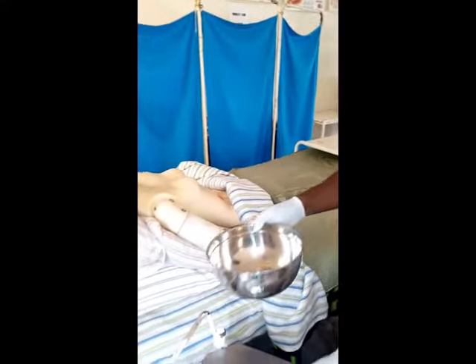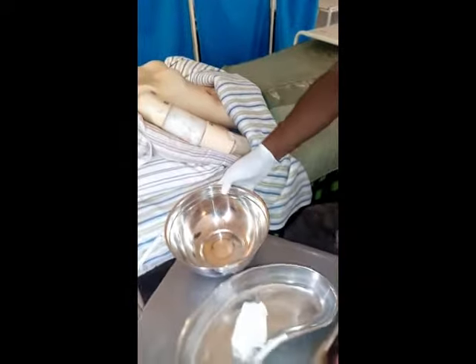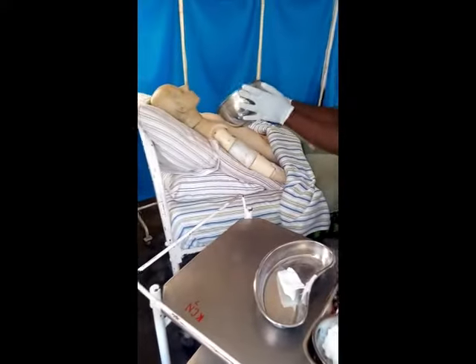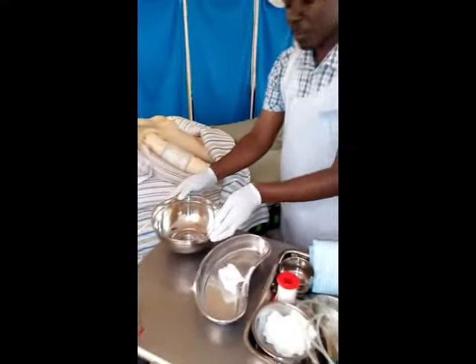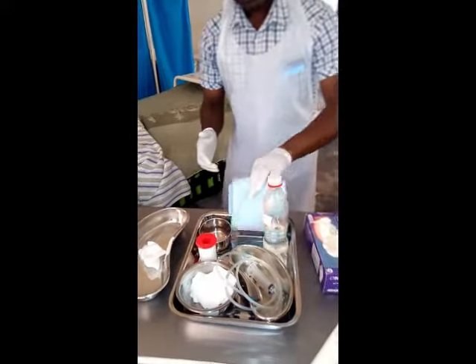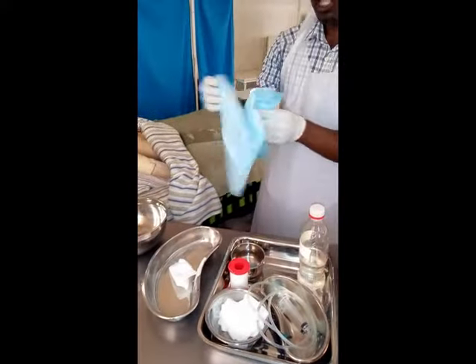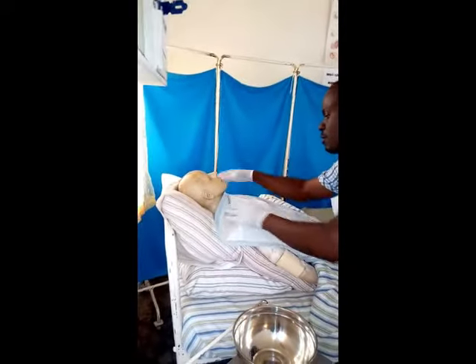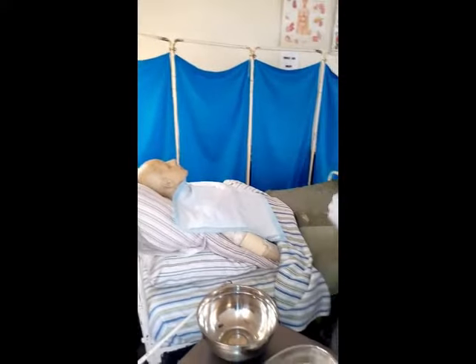I would prefer it here, so that if Mrs. Mark wants to vomit, I can simply give her this emesis bowl. So I'll put it there. At this moment I can even put an incontinence sheet there so that I don't mess up the area or the linen.